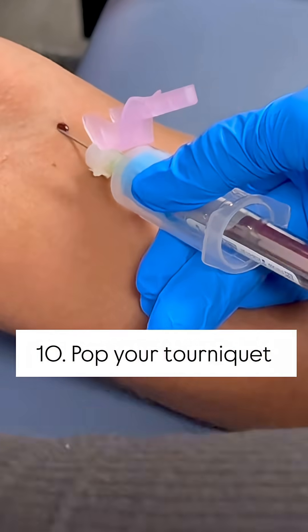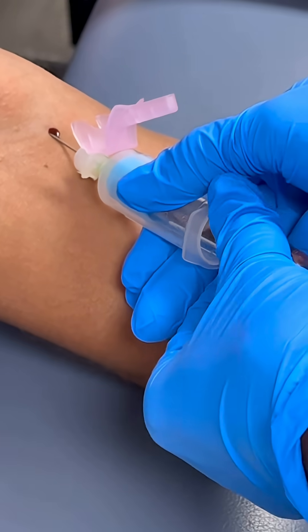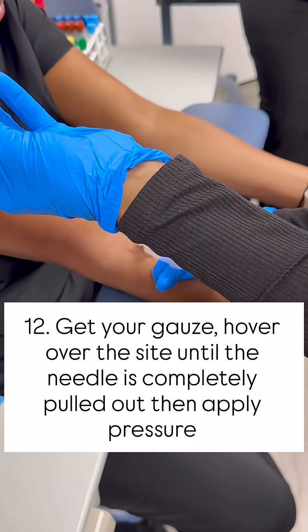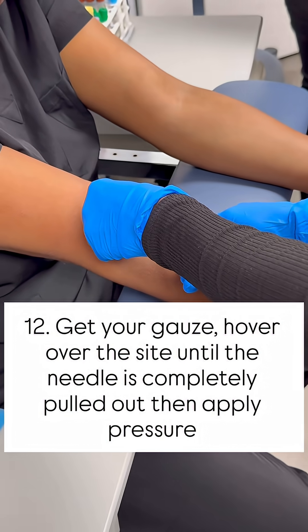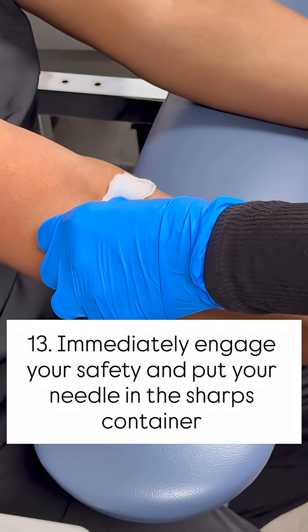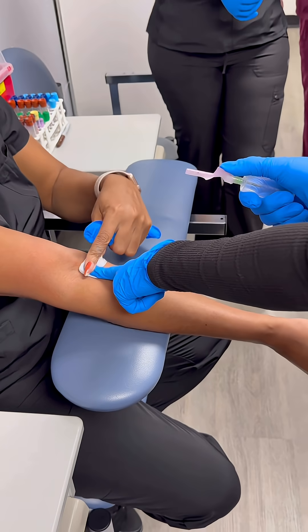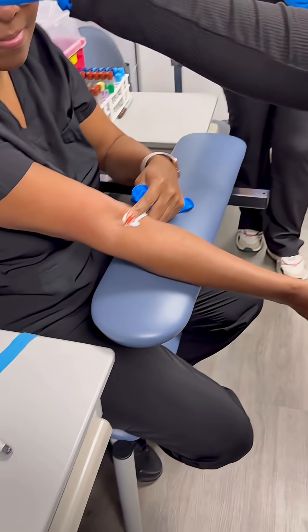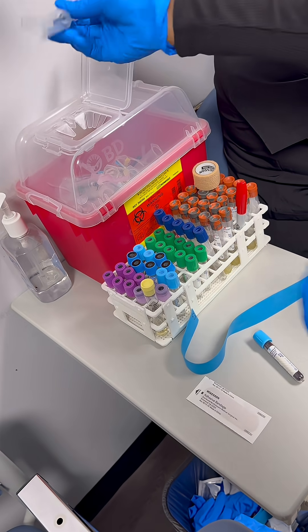Pop the tube — you see your first sign of blood. Pop your tourniquet first, then after you pop your tourniquet pull your tube out. Get your gauze, fold it in four, hover over, pull out, and immediately engage the safety. Then say: can you apply pressure there?